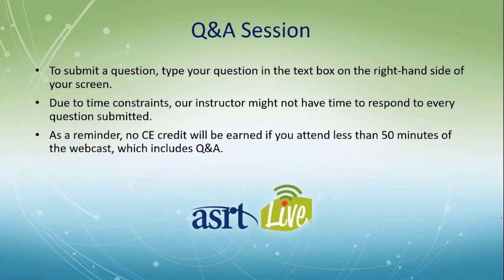The problem is, if you go back to the slides that I mentioned about the latitude of digital equipment, remember that we said that it has 10 times the exposure latitude. So the amount required now is 1%. The amount required with film was 10%. So that has changed. There is a minimum amount, but the minimum amount has gone down by a factor of 10, which is huge. And what that does is that opens up possibilities for us to, again, save patient dose.